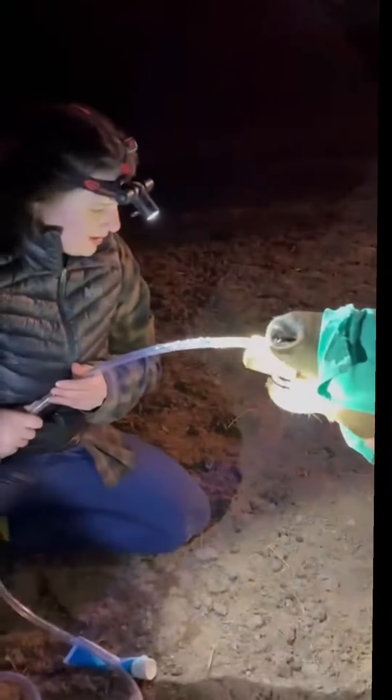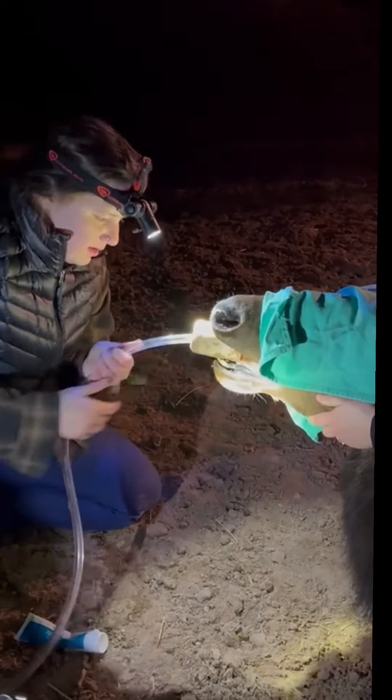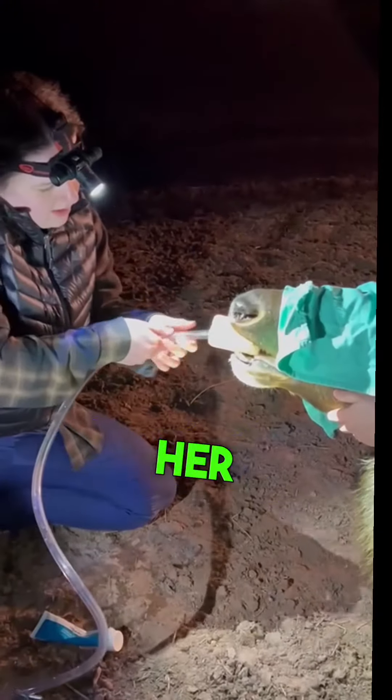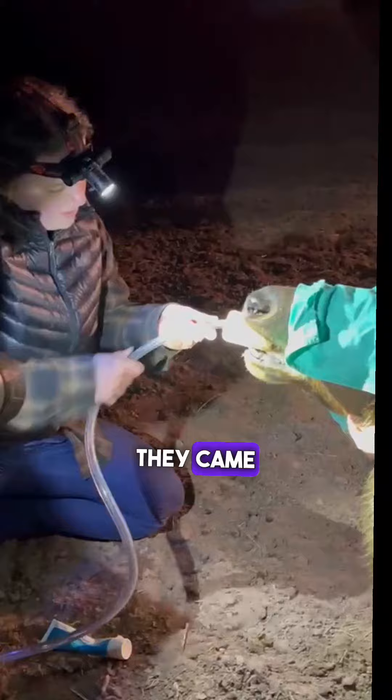This is what it looks like when you pump an elk stomach — we're going to do this a couple of times. The vet is now pumping electrolytes back into her stomach. We had an amazing vet team; they came out and helped.